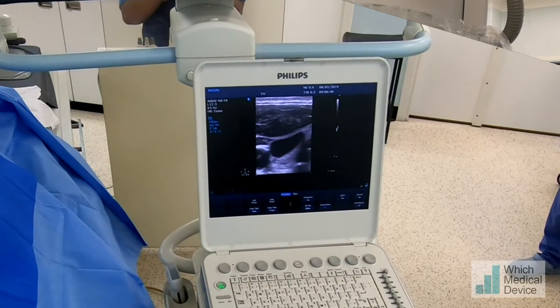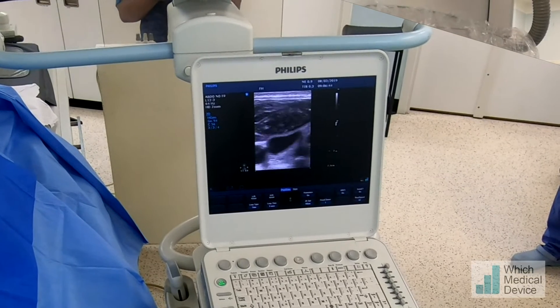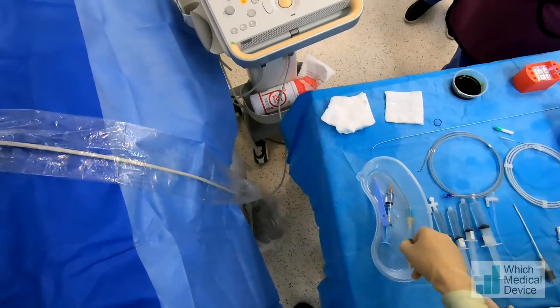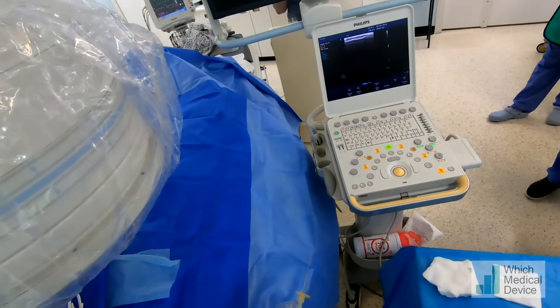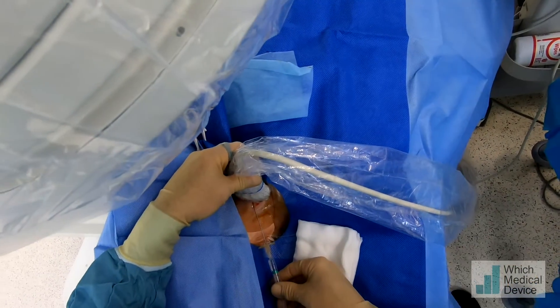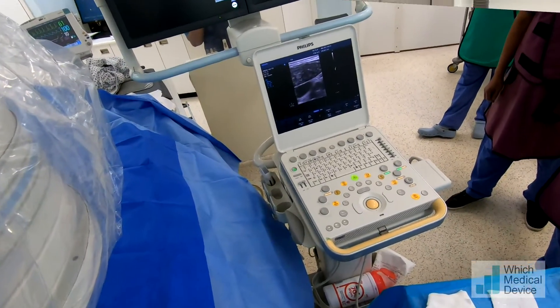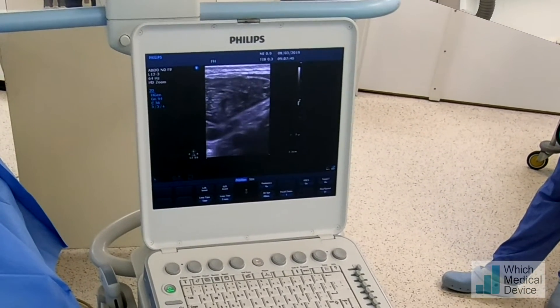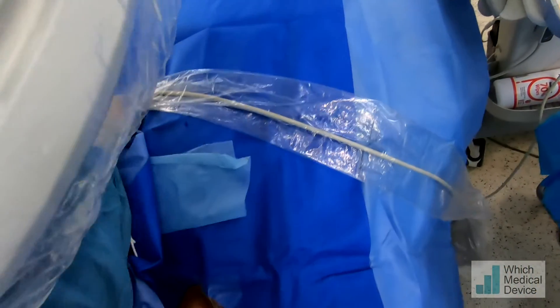You can see it's right down to the vein there on the ultrasound machine. So have the wire and the sheath ready, please. A little bit of pushing — shouldn't be anything particularly sore. You can see that's through into the jugular vein.